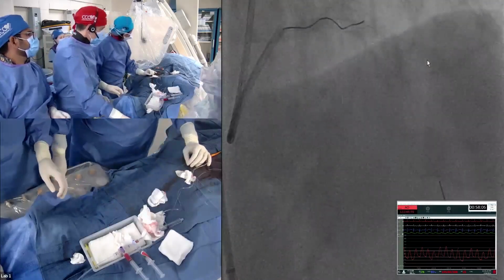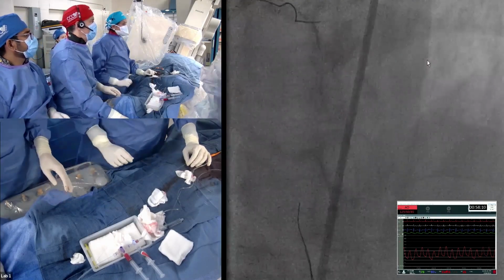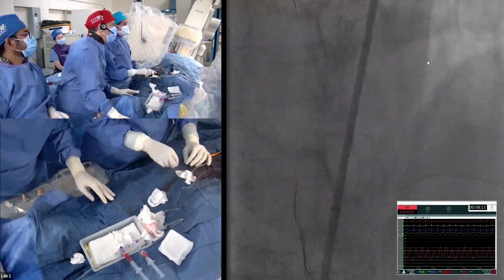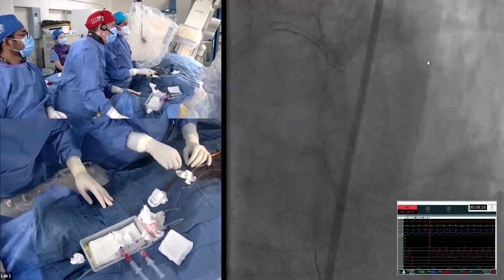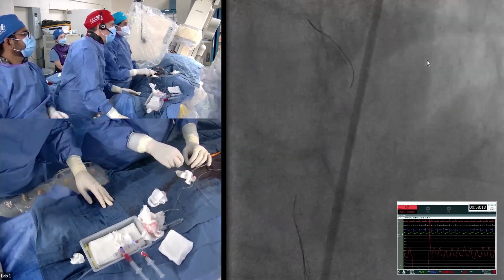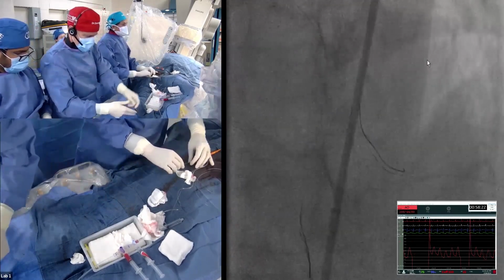I think the imaging in the LAD will tell us if there's any calcium in the diagonal. Right, if there's calcium, then maybe that side view too. You've been trained by Dr. Sharma. All right, let's see. Dr. Kinney, what do you want to do? You heard all of us.